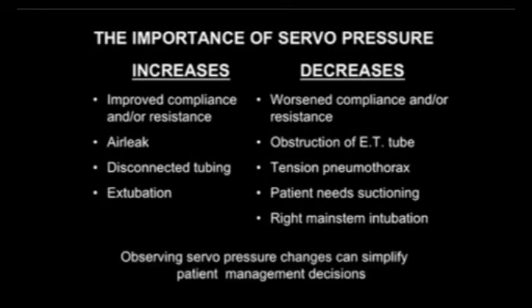Therefore, observing servo pressure changes can give you many indications that the patient's either getting significantly better or significantly worse, and can help guide your patient management decisions.